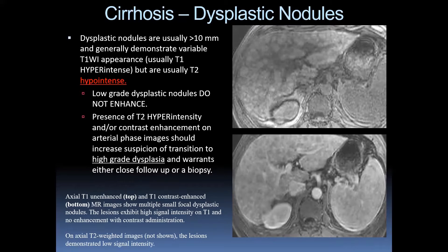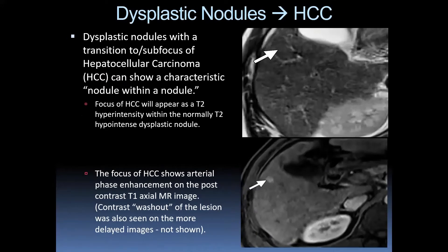Multiple small focal dysplastic nodules appear bright on T1 with low signal intensity on T2 and no associated enhancement. Dysplastic nodules transitioning to HCC can show a characteristic nodule-within-nodule appearance — the focus of hepatocellular carcinoma appears T2 bright within the normally T2-dark dysplastic nodule, and shows arterial phase enhancement on post-contrast T1 weighted imaging. Contrast washout of the lesion is also seen on more delayed images.